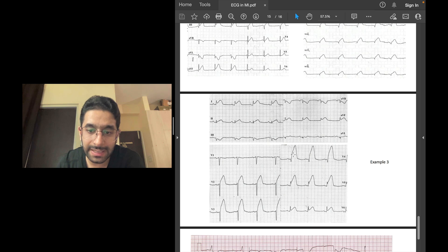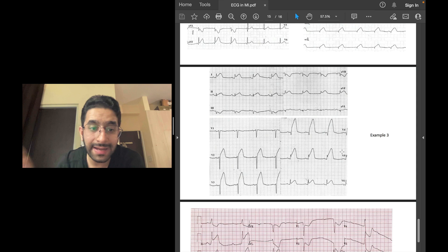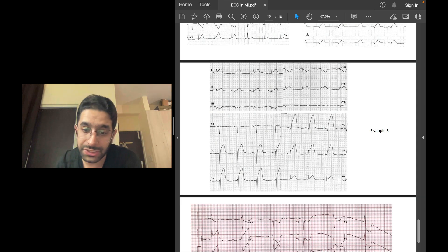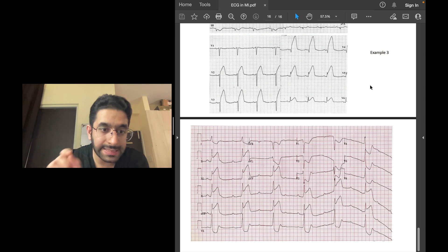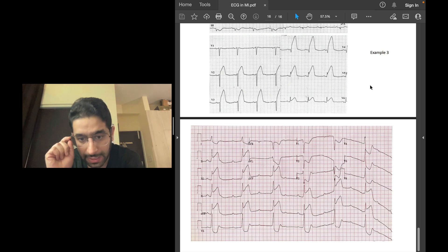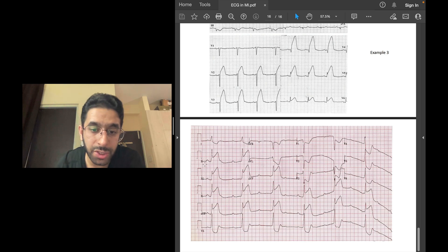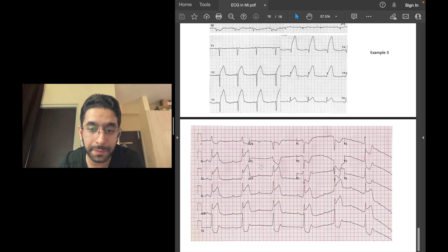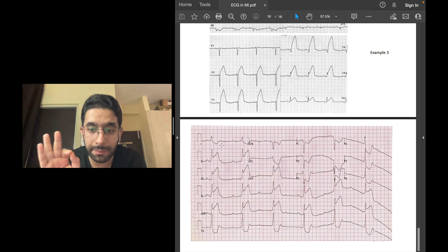In this third example, there are clear-cut ST elevations in leads V2, V3, V4, V5, V6, lead 1, and AVL — an anterolateral ST elevation MI.